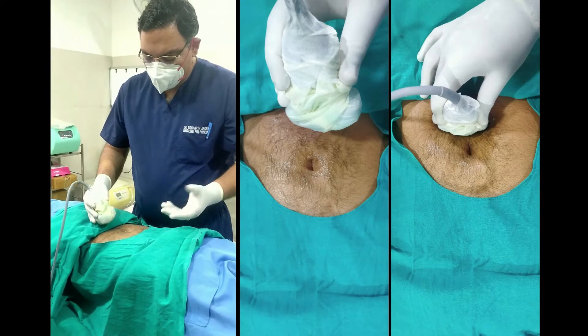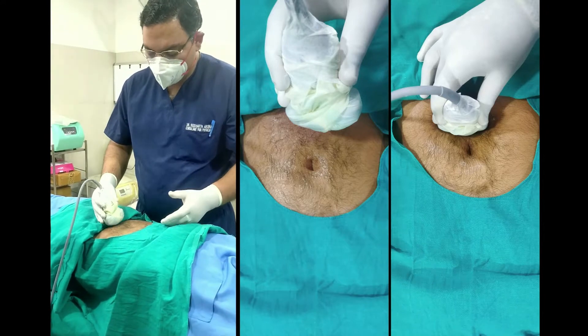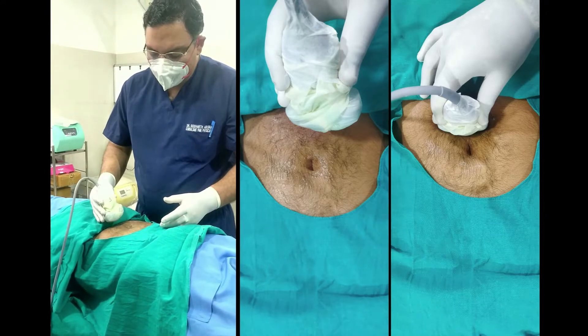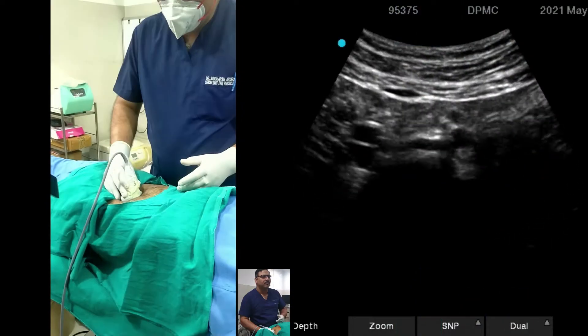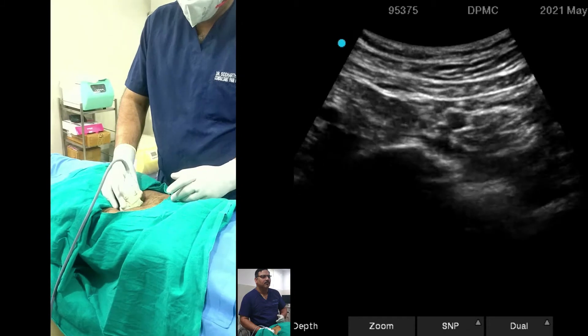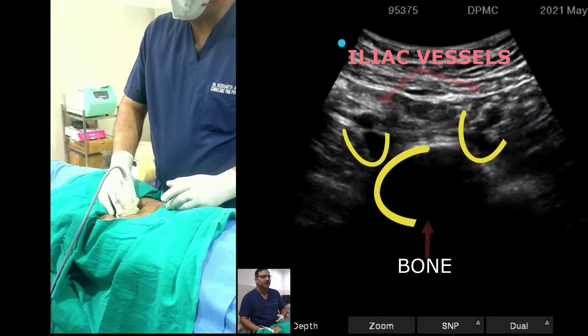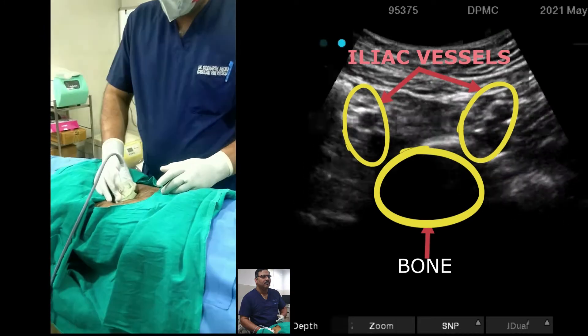This is the umbilicus. You can ideally place your probe approximately 2 to 3 cm below the umbilicus. Put the curvilinear probe and as you place it, you will see that the aorta divides at the level of L4-5 into the iliac vessels. So you are going to see the iliac vessels on both sides.